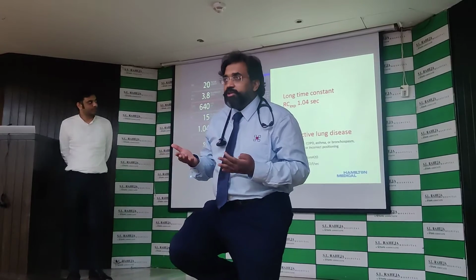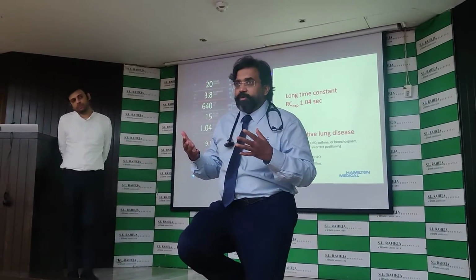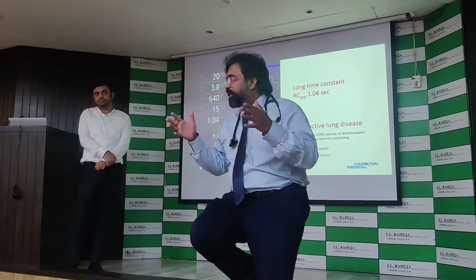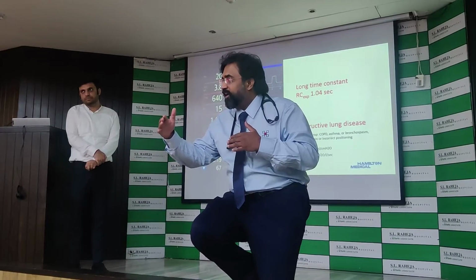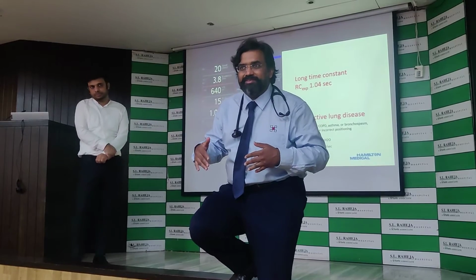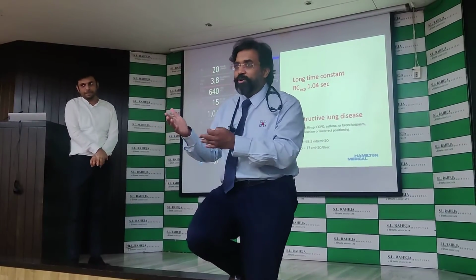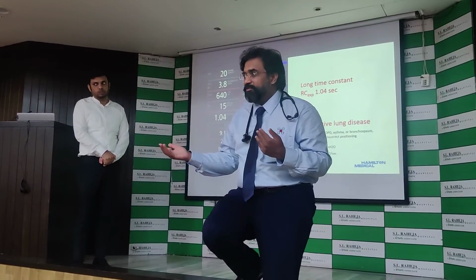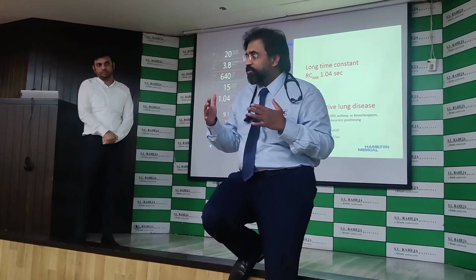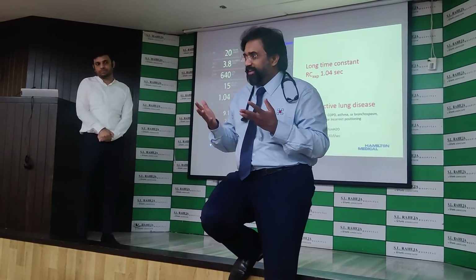Take the example that the patient has obstructive airway disease. He's going to take a longer time to fill because he's got a bigger volume. So my inspiratory time has to be high, and my expiratory time is also going to be high, because it is going to take a longer time to empty. In fact, it will take even longer to empty because it's passive, active versus passive. Whereas when it is a restrictive lung disease, your time constants become smaller. So the I:E ratio and RR will change accordingly.